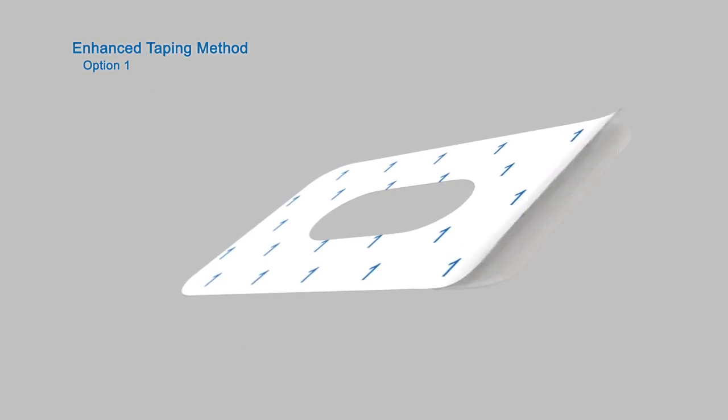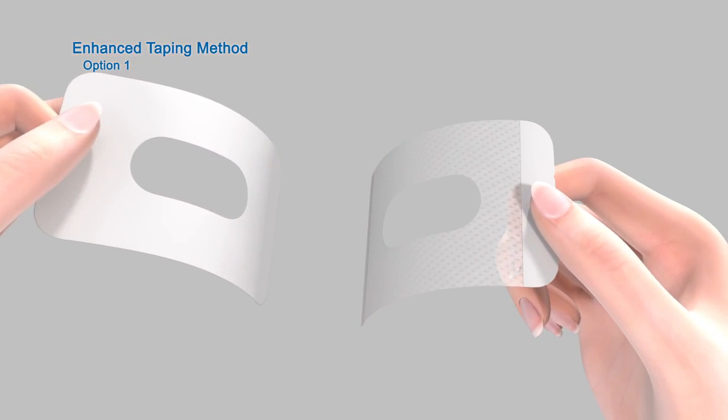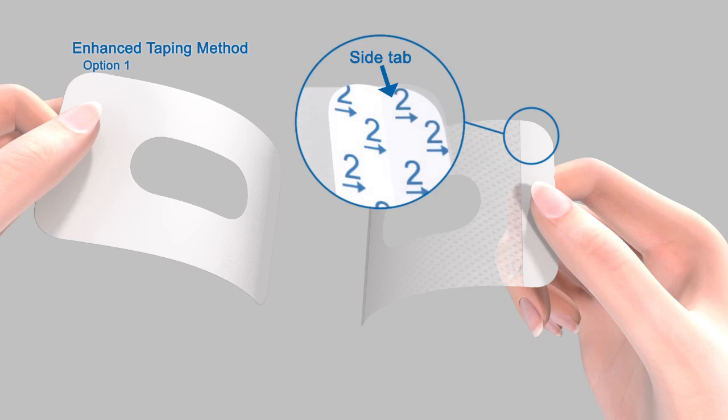Now let's see how to apply the tape in Option 1. First, remove the paper backing marked by the number 1. Do not remove the two smaller tabs on the sides of the overtape just yet.